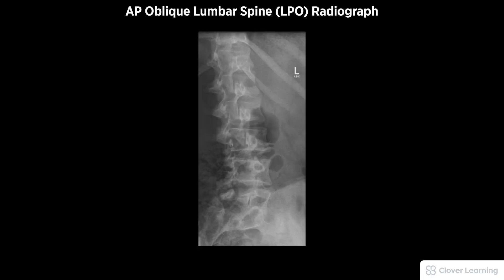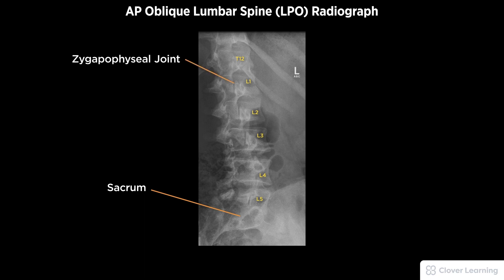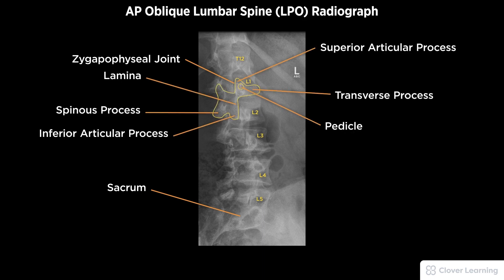A diagnostic AP lumbar spine left posterior oblique LPO view radiograph must be free of motion. Demonstrated anatomy to include T12, five lumbar vertebrae, and the sacrum, the zygapophyseal joints closest to the image receptor, the appearance of the Scotty dogs, and proper visualization of soft tissue and bony detail.